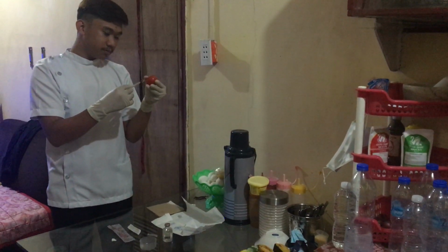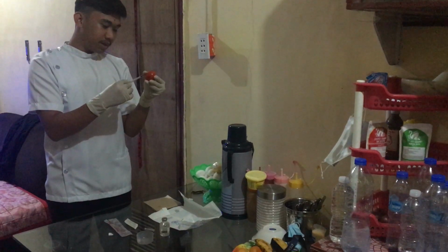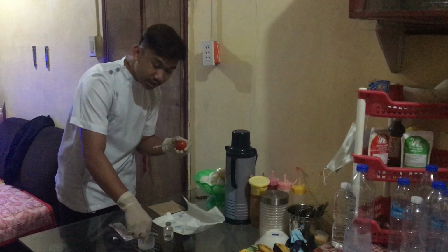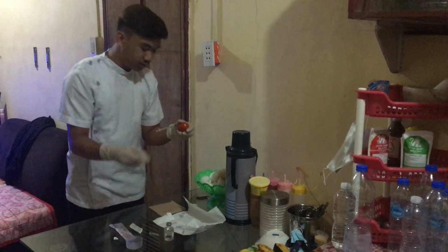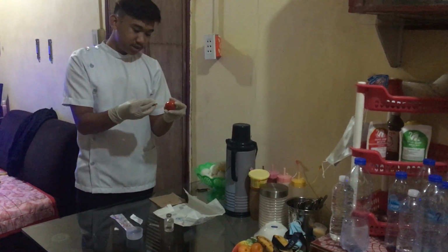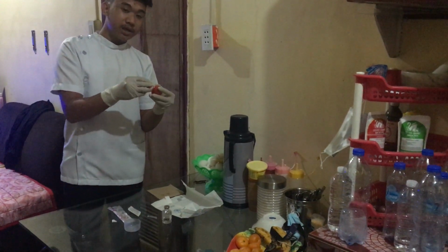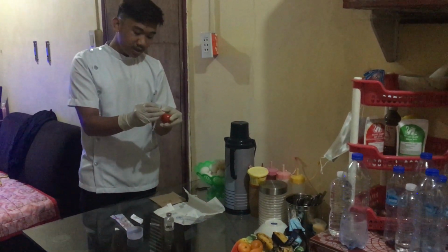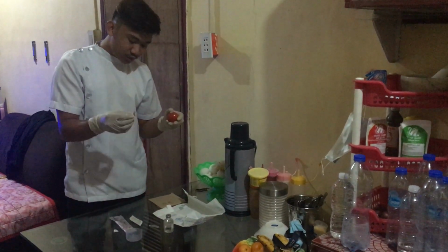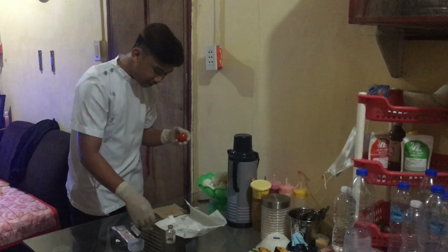of medicine. Then after that, you're going to get a cotton ball. After you remove the needle, you're going to put a cotton ball on the part that you injected.